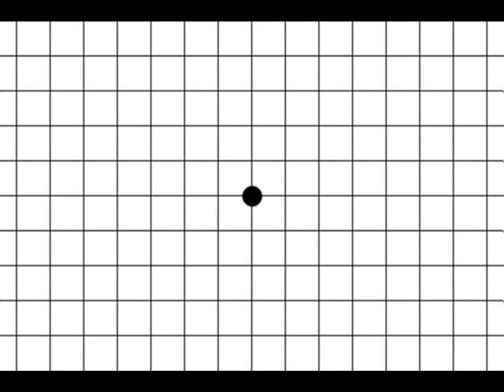An Amsler grid is simply a grid of 5mm squares with a central fixation dot in the middle. A normal grid is 10cm wide by 10cm high. To print one out, just google Amsler grid PDF.